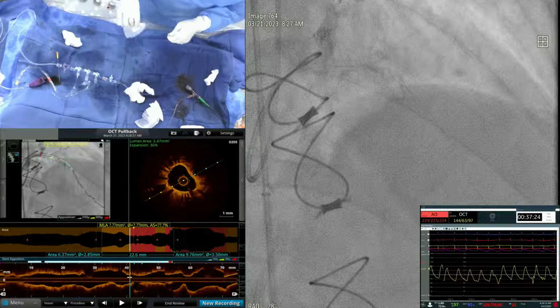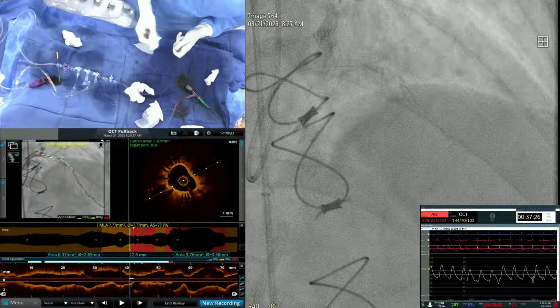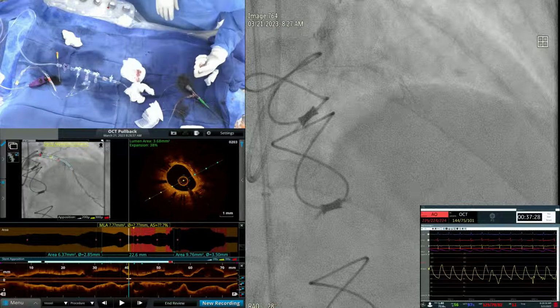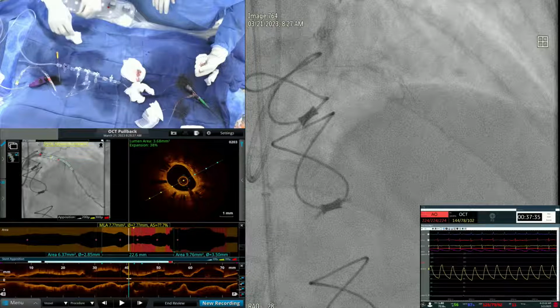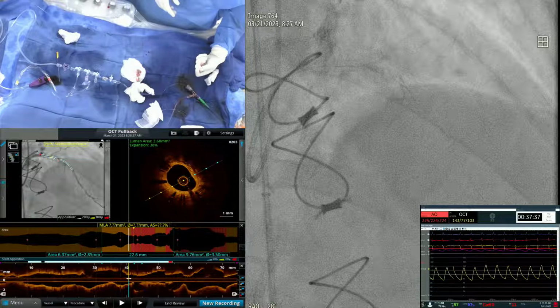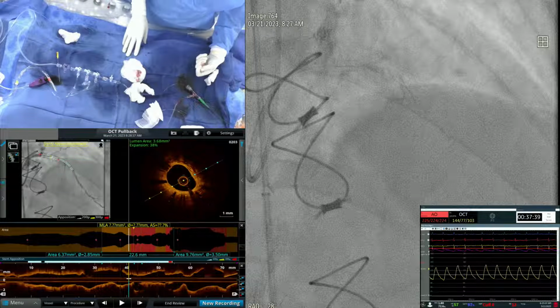Should we do OCT again or move on with the IVL? Or we can check the balloon dilatation, balloon reaction, because just the OCT after just the Rota. Maybe check how much additional is ablated. No, let's do IVL now straight, right? Yep.